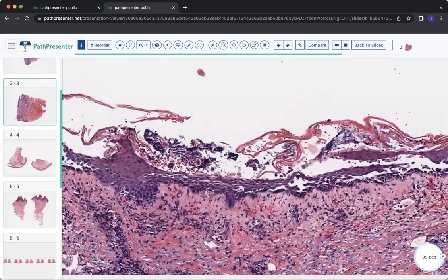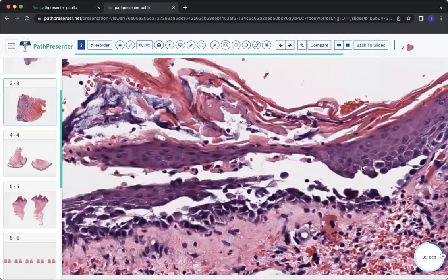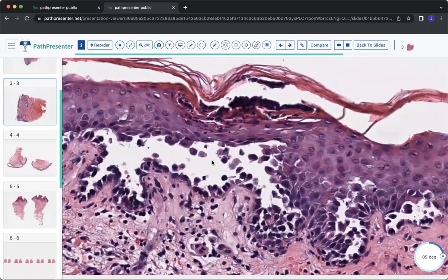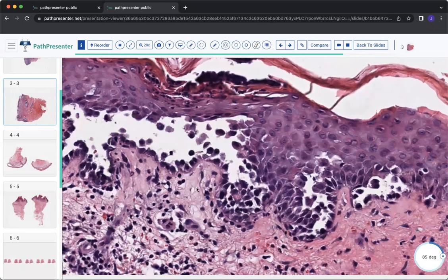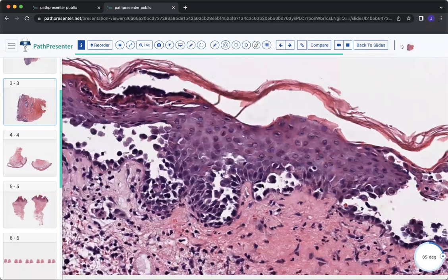So this is a type of pattern where you could probably at least label this acantholysis. And when you see acantholysis, you should be thinking, again, about the previous entity, pemphigus vulgaris, but when you see acantholysis like this and you don't see a lot of dyskeratosis, this pattern is called a dilapidated brick wall. And so again, I'm throwing out these buzzwords for you. If you're taking the exam, no one's going to actually tell you these buzzwords. So it's a little bit easier for you to jump to the diagnosis here.